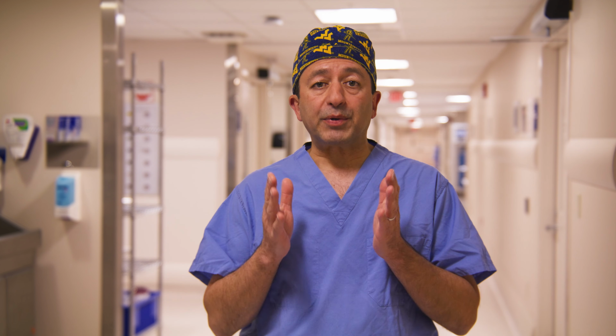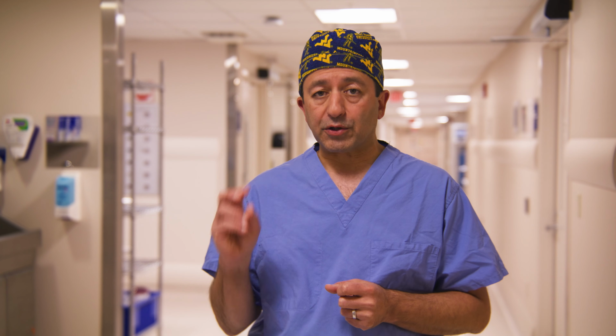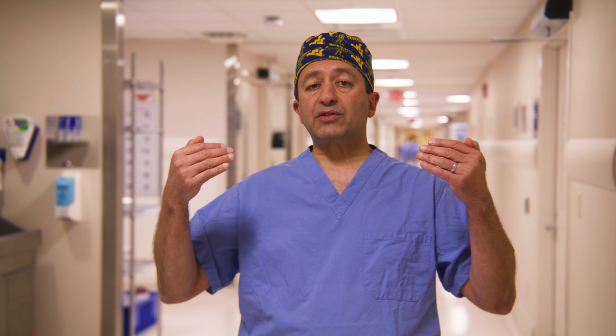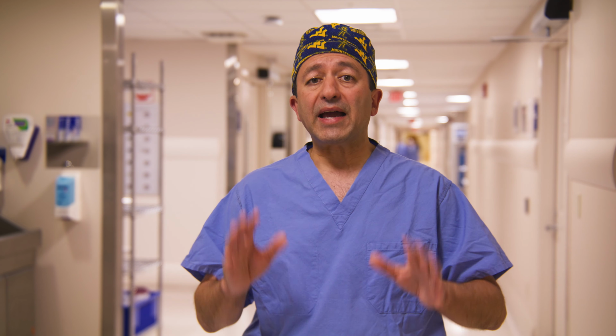Hello, everyone. So now we've learned the basics of mitral valve repair of P2 prolapse for the treatment of type 2 primary degenerative mitral regurgitation. Sometimes, particularly outside of the continental United States, patients have rheumatic heart disease, and that is type 3A restrictive pathology, or type 3B is associated with heart failure and restriction of the leaflets, a very different mechanism. And sometimes in that case, replacement may be preferred.